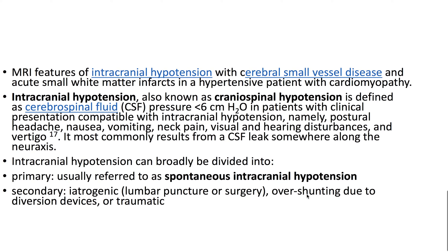The MRI features are consistent with intracranial hypotension with cerebral small vessel disease and acute small white matter infarcts in a hypertensive patient with cardiomyopathy.